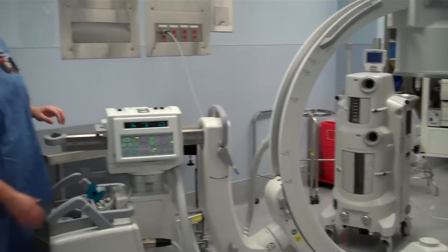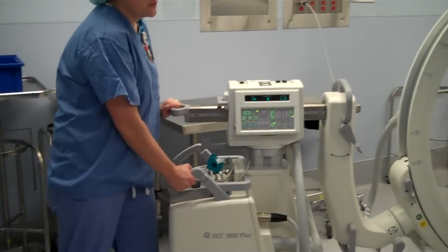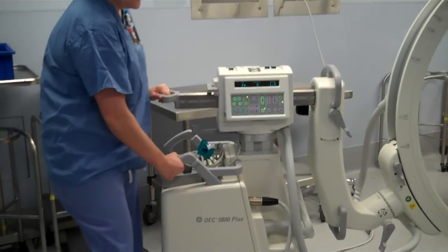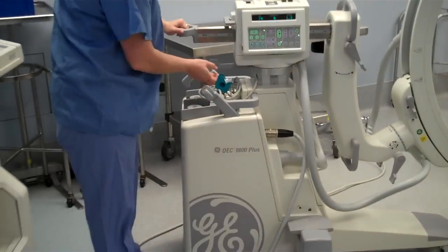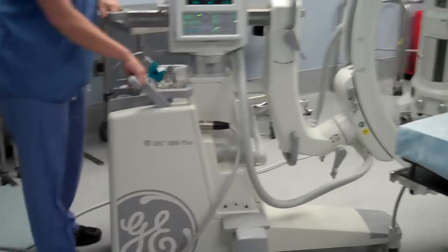First of all, I want to show you the way that the base of the C-arm can move. If the handles are turned straight this way, you can move it front and back. It's very, very heavy though. If you need to move it sideways, just turn the right handle out to the side, and you can very easily slide the arm to the side.